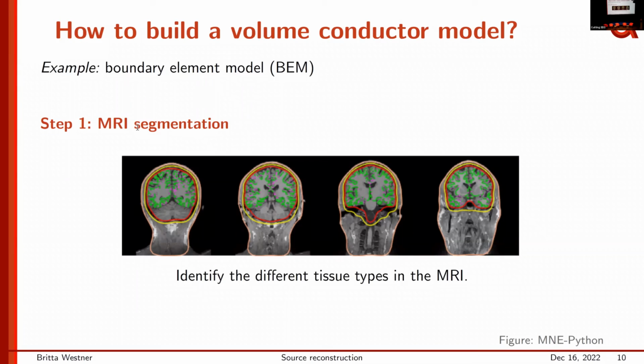There is a paper by Dennis Engemann and Alex Gramfort looking at different ways of regularizing your covariance matrix, also shrinking your covariance matrix, which all helps with that problem of rank deficiency. So that might also be a good resource to learn more about this topic. And since it's Alex, there is math in there.